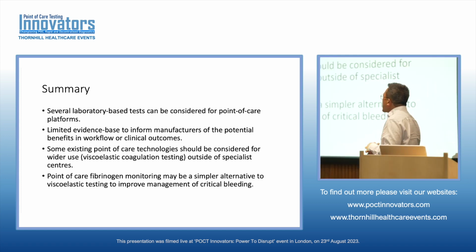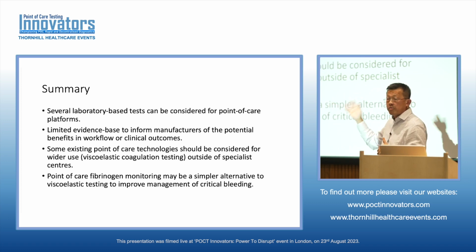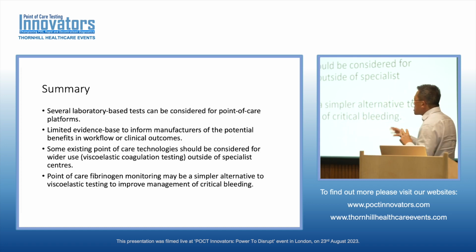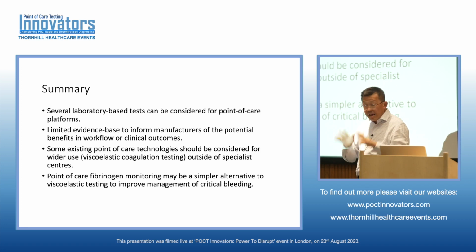There are some point of care technologies that are, at the moment, used in semi-specialist areas that I really, really believe would benefit patients if we roll them out more, such as the viscoelastic testing, for example. As I said to you, every maternity unit in Wales has a ROTEM device, and I can tell you that has transformed the management of obstetric bleeding patients in Wales. Why Wales? I don't know, but there were one or two people that were very keen on it, had an interest in it. They talked to the company, and they did a trial. And I think that is the way forward.